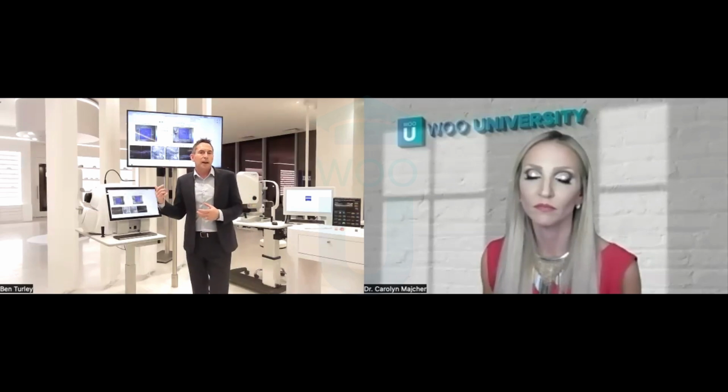But if you were to image the same patient with a different wavelength, the green filter set, that patient may actually show signs of life, shall we say, elements of that edema that we're looking at. You might physically see, from a GA point of view, elements that are still alive, or even new vessels. So all of this is important to us from a wavelength perspective, and actually the green seems to be preferred over the blue in many cases.